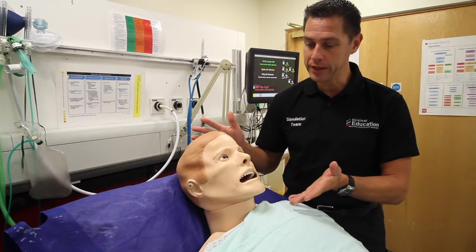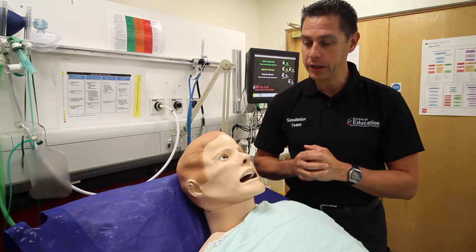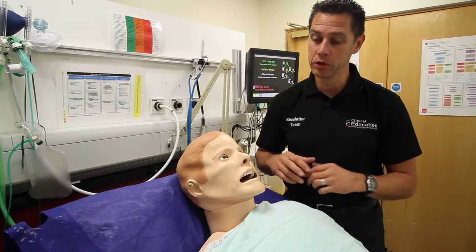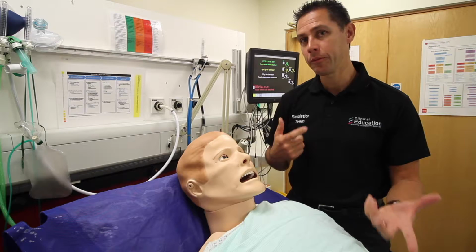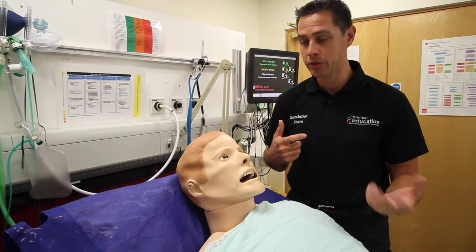So starting with his head, as you can see, if you wait long enough, you'll see him blinking. He blinks away nicely. His eyes can be open, they can be closed, they can be half open to kind of simulate his level of consciousness. So watch out for that when you're doing your scenario. His pupils can be made to react to light. They can be equal, they can be unequal. So it's worth having a look at them when you're examining your patient just to get an idea what's going on with those.